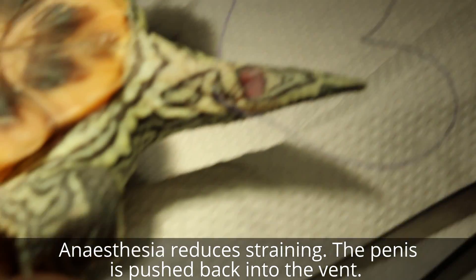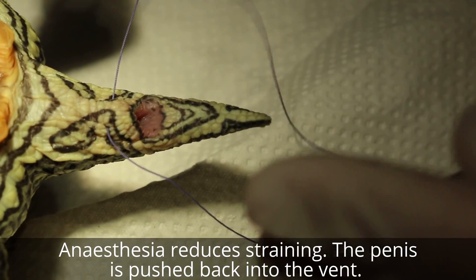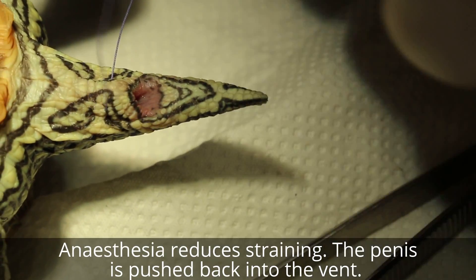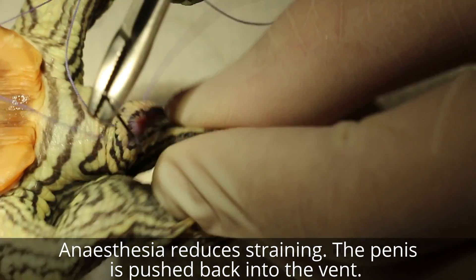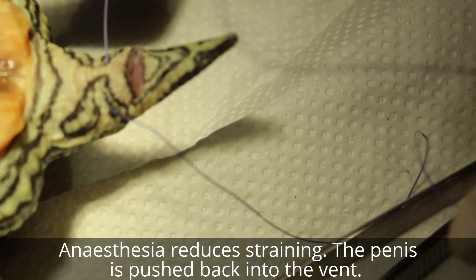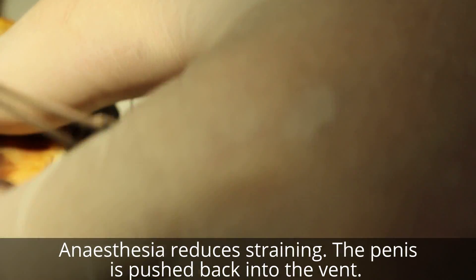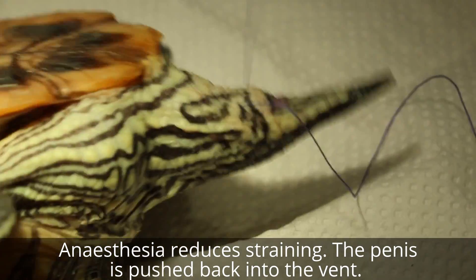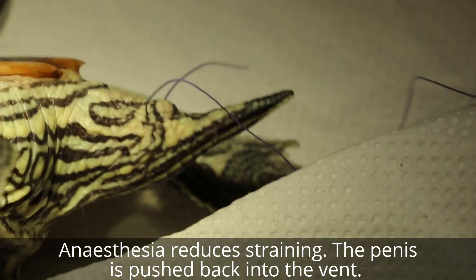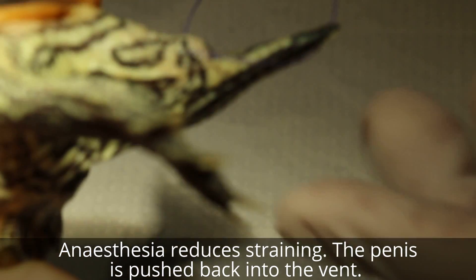It's called a purse-string suture because it goes around like the back of a purse. So it goes around the circumference. It's waking up - have the assistant turn a bit to the side so that I can see. Lift up a bit - make sure it has gas. Here's the gas.